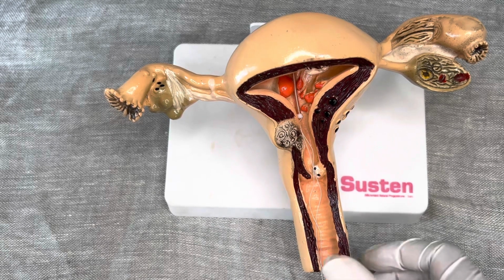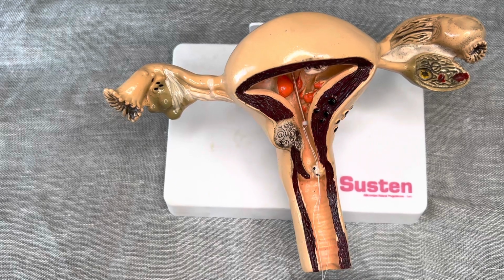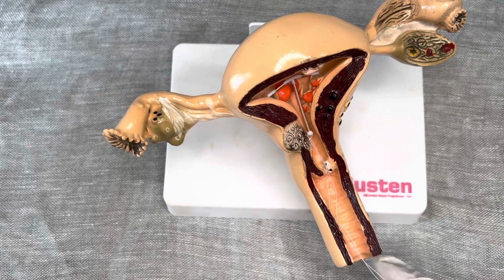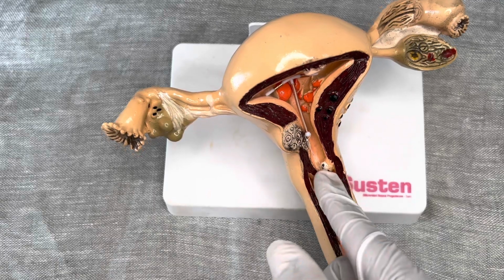The other thing to note is this thing is not supposed to come out. Once it's lodged in there, it's supposed to be safely fastened, especially when you've tucked it in behind the posterior fornix, and you don't have a problem of it coming out.